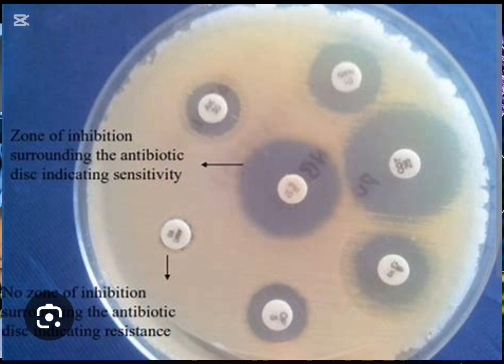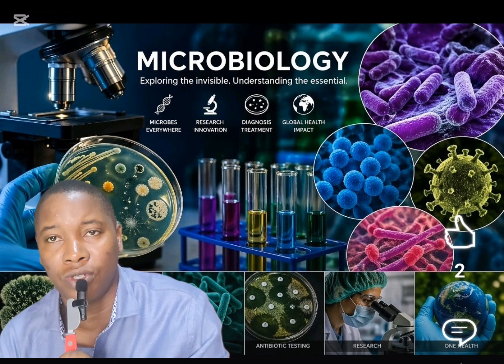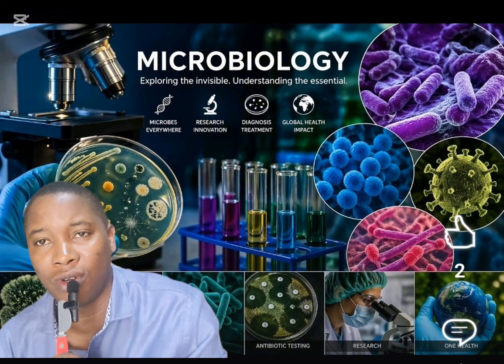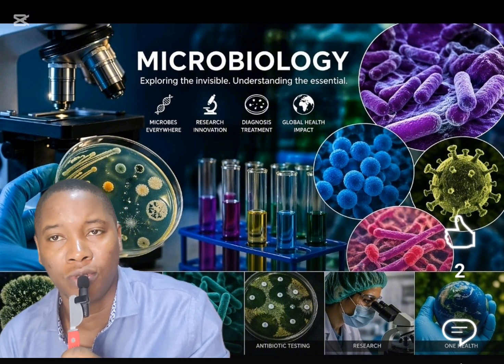It's very important for scientists that we understand this process, we understand what is happening, we understand the interpretation. Like I said before, we use the CLSI guidelines to interpret, or EUCAST. It's another European body whose standards we also use to interpret. And what are we interpreting? We're interpreting the zone of clearance. How wide is the zone of clearance? We measure the diameter of the zone of clearance using a ruler, and then we match it up with the standards in the CLSI book, and depending, we are able to come to a conclusion.